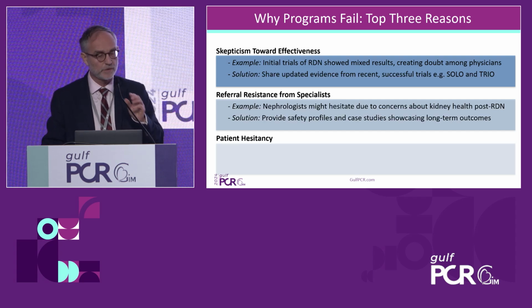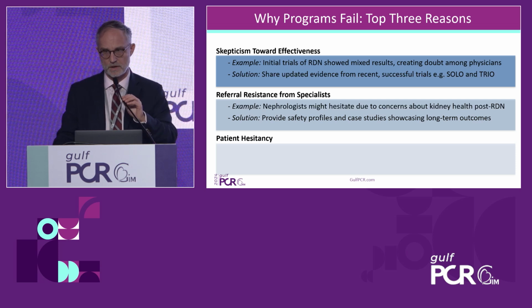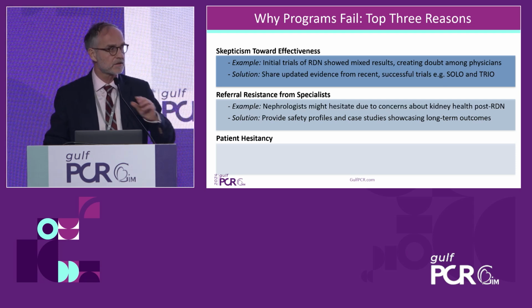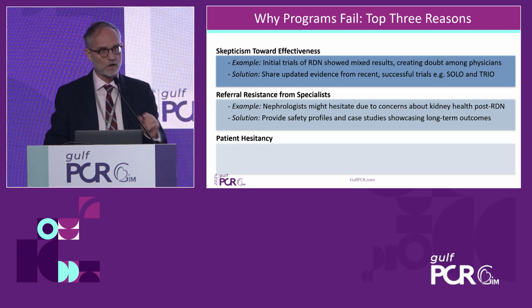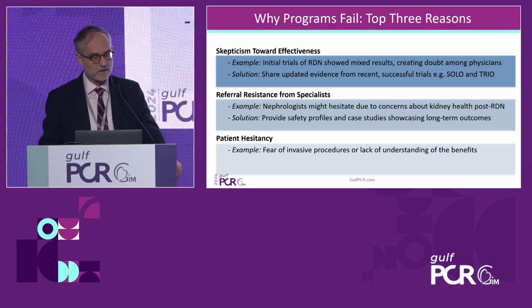What is the solution? We need to provide them with the safety profiles, and there's no signal so far showing that it's bad for the kidneys. Actually, there's some data showing that the reduction in GFR is even slower after renal denervation than the natural history. And then we have patient hesitancy.